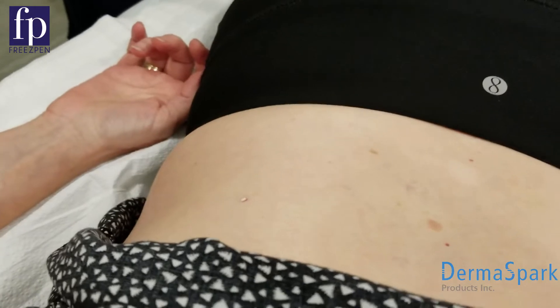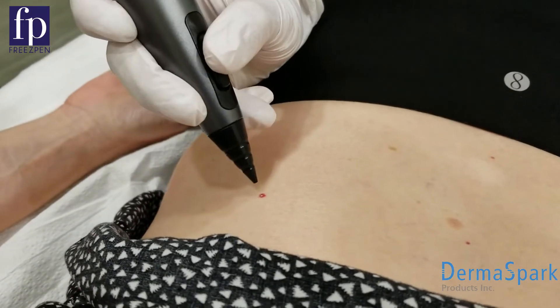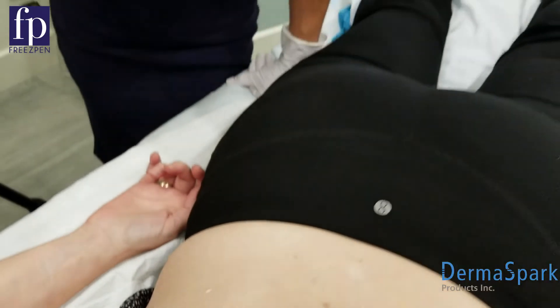I'm going to let that thaw out before it's fully dissipated, then start the second cycle — so the method is freeze, thaw, freeze. These superficial lesions do peel and fall off relatively quickly, within about a two-week period or so.